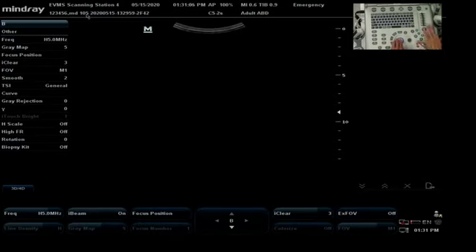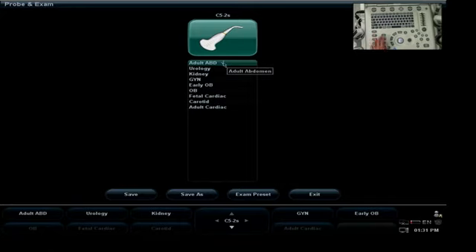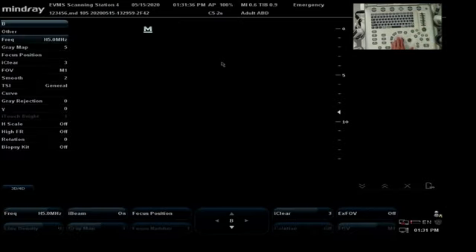We're going to leave all our other controls neutral, except we're going to hit the button on the left side of your keyboard that says exam. And when you hit exam, you can see all of the selections that are available for this probe. So I have selected a curved array, and I'm going to leave it on abdomen, although urology or kidney settings, either of these, you have 3 to choose from, would be acceptable.